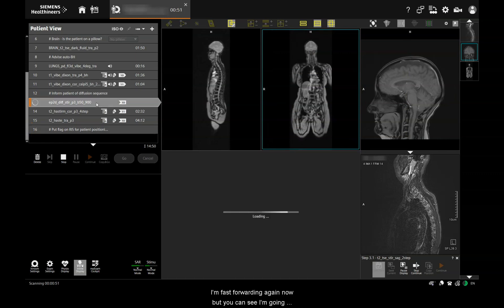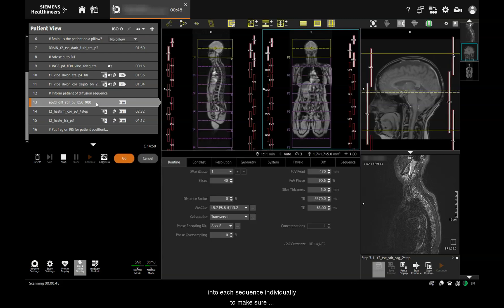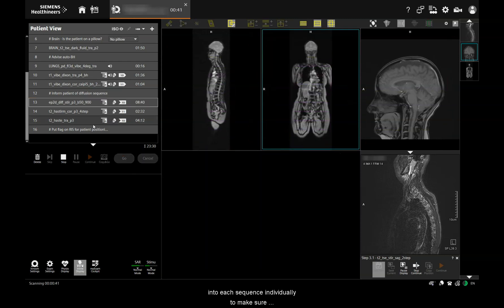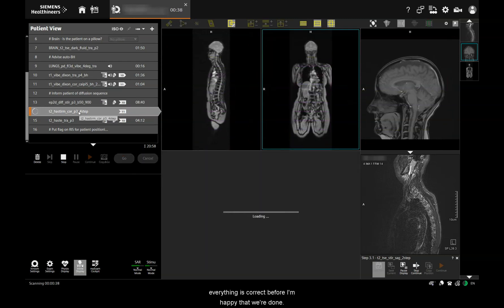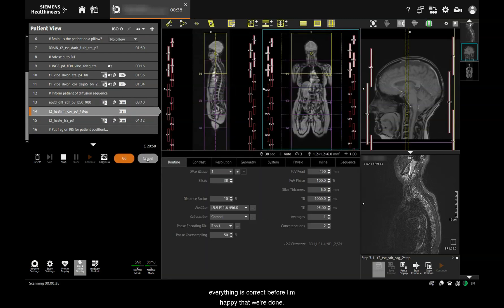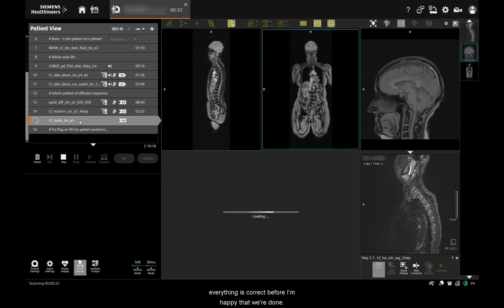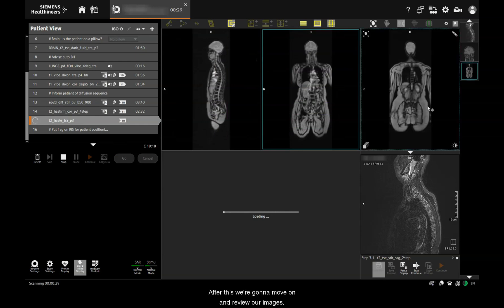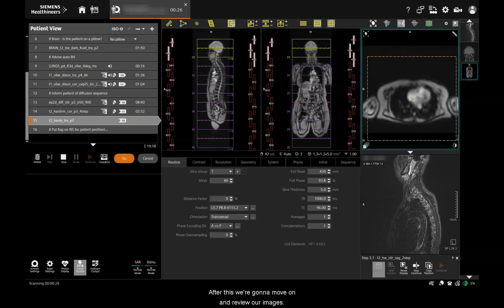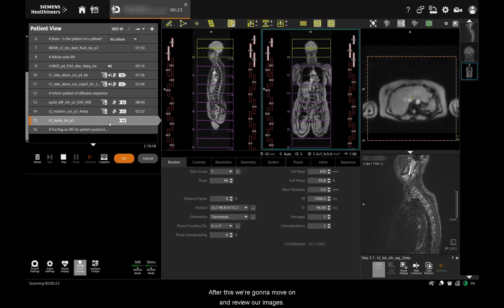I'm fast forwarding again now, but you can see I'm going into each sequence individually to make sure that everything is correct before I'm happy that we're done. After this, we're going to move on and review our images.